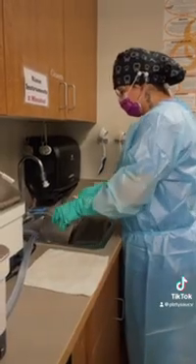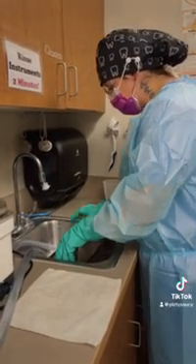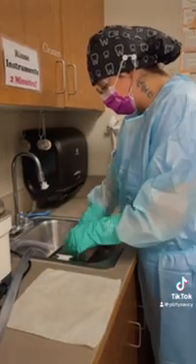We're now going to hold the basket at an angle to allow excess water to run off, and then we're going to carefully remove the instruments onto a towel.